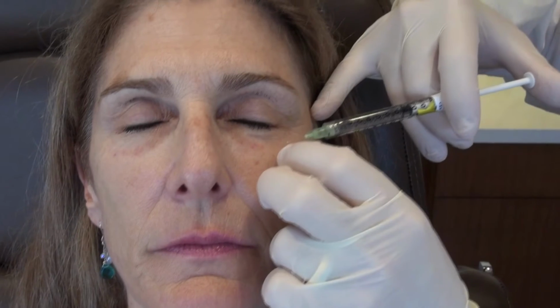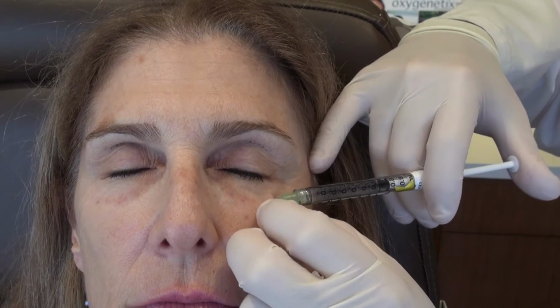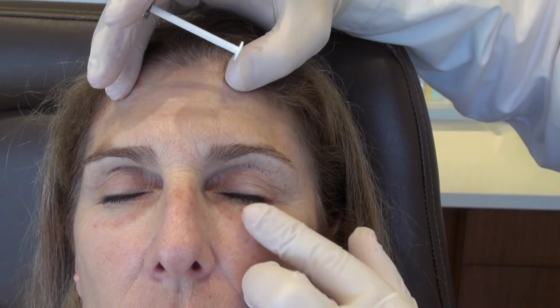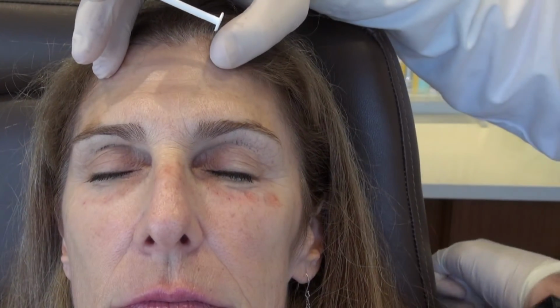Okay. The reason why Juvederm in the tear troughs fell out of favor in the first place is that people were coming back with a lot of swelling, because the Juvederm, being so hydrophilic, absorbed a lot of the patient's own water from their tissues and wound up looking bumpy or swollen, and it would swell or go up and down depending on the patient's state of hydration.